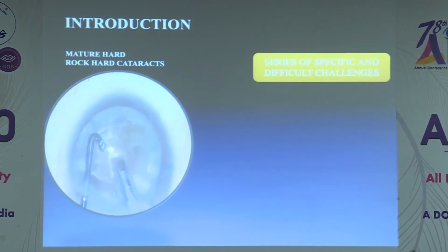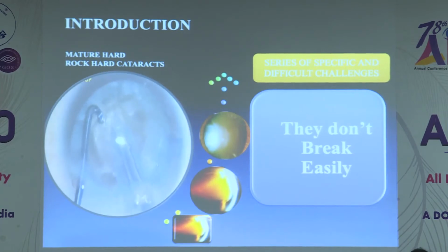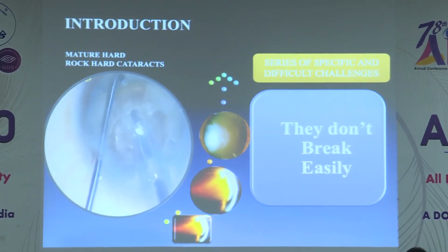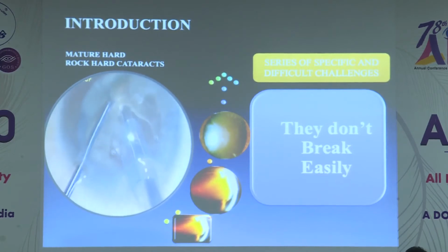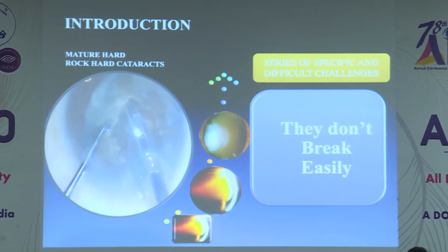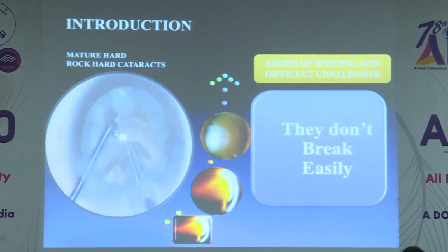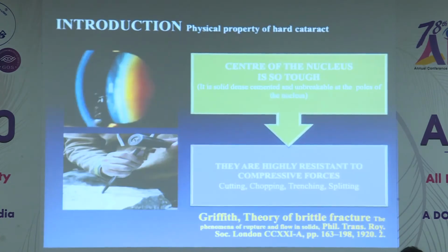And the most important problem is that they don't break easily. That is the biggest problem we all face in hard cataract surgery: how to break the nucleus. The nucleus doesn't break with many of the techniques, whichever technique you use. You can break these nuclei with the existing techniques, especially if you have a nucleus of grade 2, grade 3, grade 4, but when you come across grade 5, grade 6, or even the hardest of hard cataract, the rock hard cataract, then you are unable to break the nucleus. So you have to do a lot of trenching and a lot of other maneuvers.